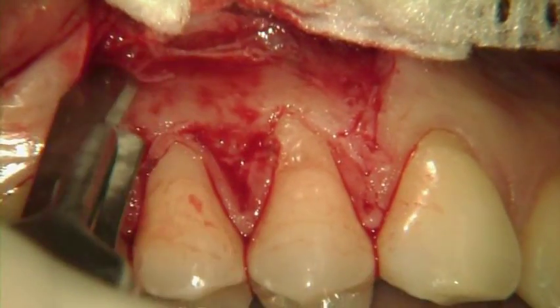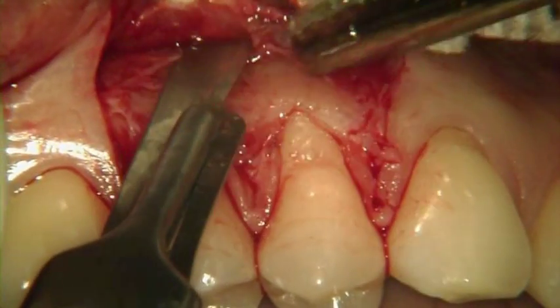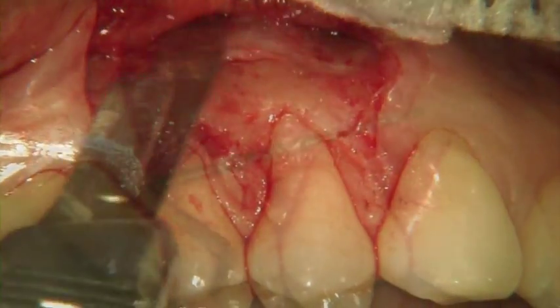Tension must be relieved in the vestibule in order to allow passive coronal advancement of the flap. Using the number 15C blade, the surgeon releases the tissues within the vestibule, allowing passive advancement of the flap.